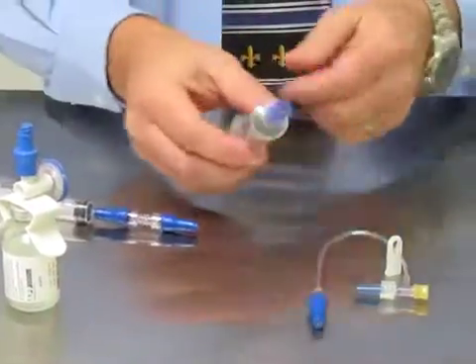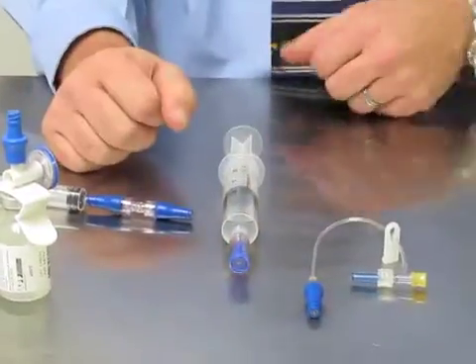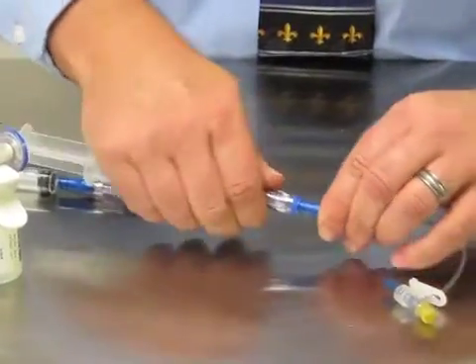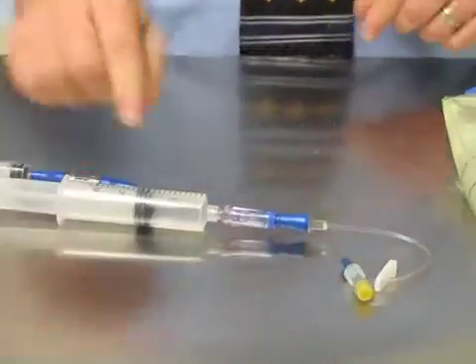I disconnect — now I'm ready to give my drug IV push. At that point, I'm just going to attach it to the patient's side of the T-port and administer.